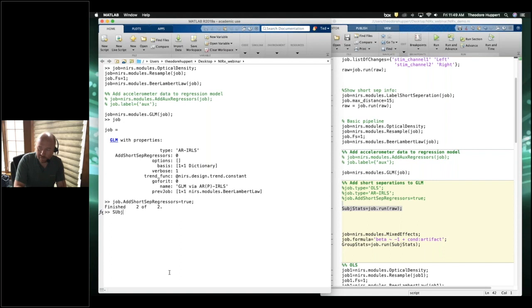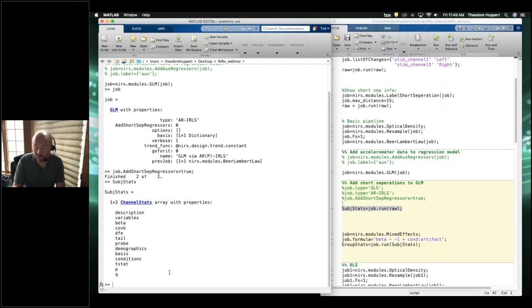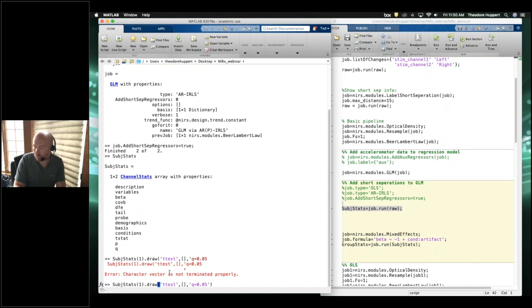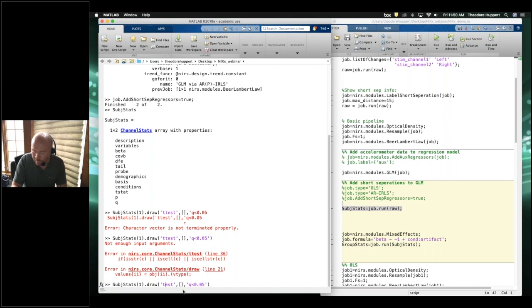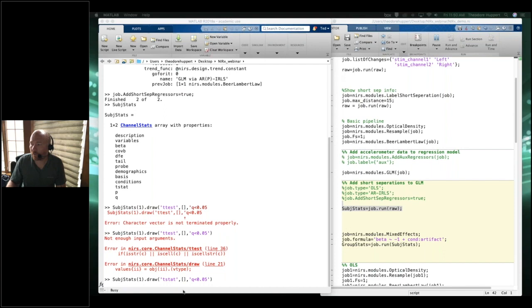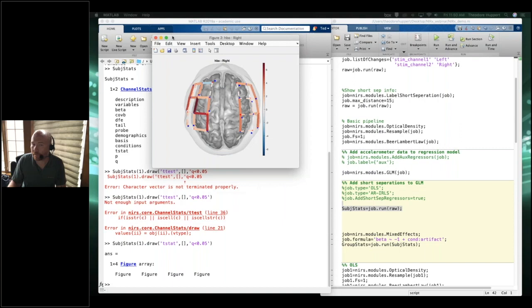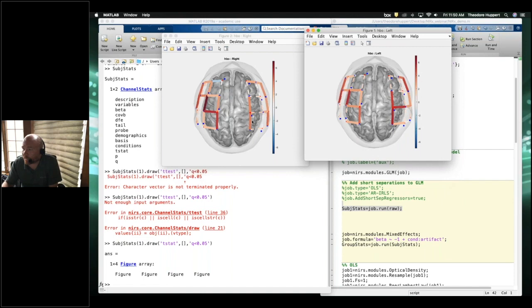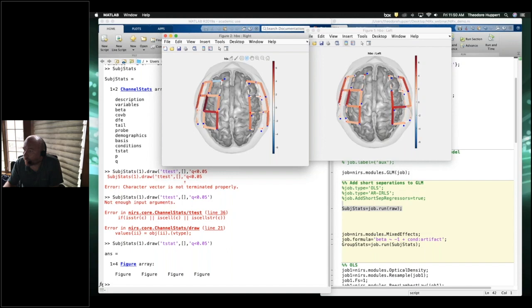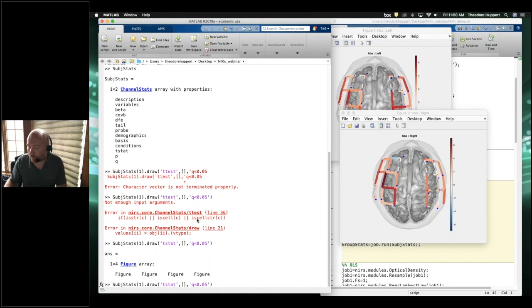We run this on the first and second files and get a field called subject_stats with two entries. Drawing the t-stat with auto-scale and q less than 0.05, looking at oxyhemoglobin: for right tapping we see left-sided activity; for left tapping we see right-sided activity. This is the first data file — the one without as many motion artifacts.